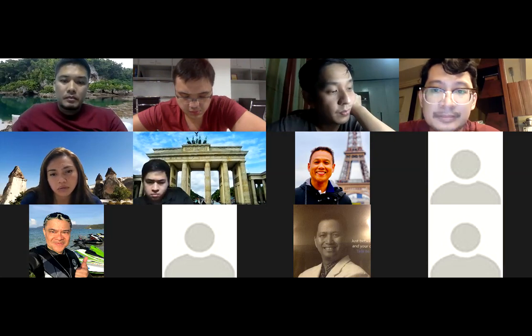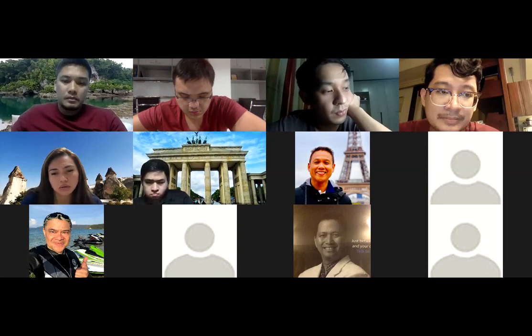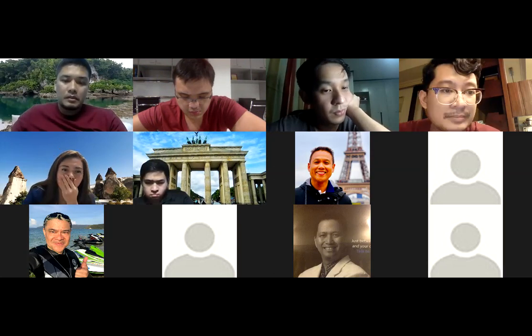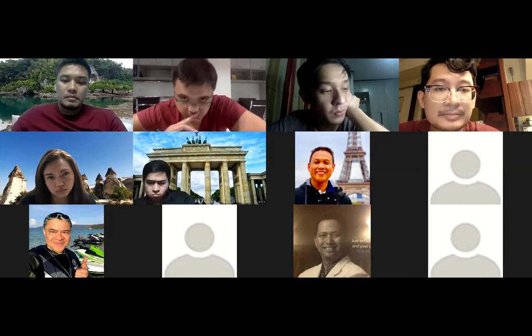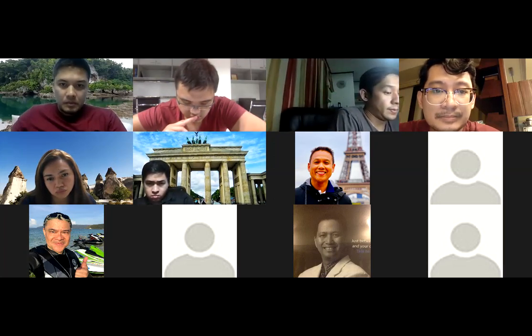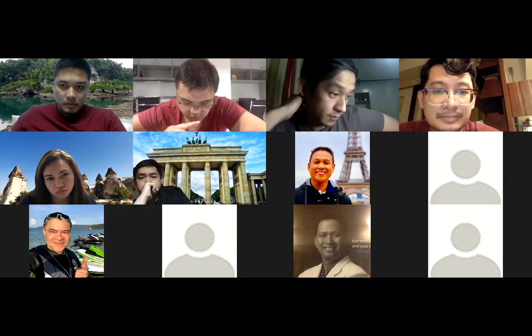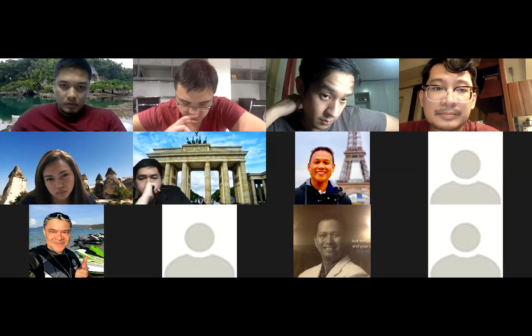Kasi hindi lang naman yun yung capacity, hindi lang naman dalas siyang umihi. Di ba? Yung mga ganun. So, makukuha na agad, baka mamaya pa lang, alam mo na kagad na ganito yung problema ng pasyente. Confirmation, yes, confirmation si Urodynamics, kasi siya lang naman talaga yung pwedeng may metrics with regards to the lower urinary tract function. Kung may dysfunction yon, mami-measure mo siya to the point. Pero yung ibang sa voiding diary, magkakaroon ka na ng idea.